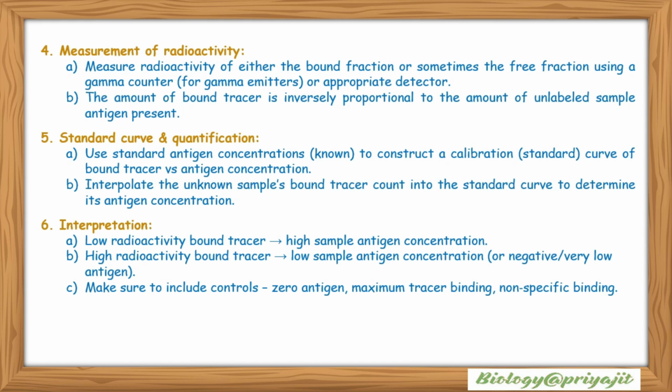Measurement of radioactivity: measure radioactivity of either the bound fraction or sometimes the free fraction using a gamma counter for gamma emitters or an appropriate detector. The amount of bound tracer is inversely proportional to the amount of unlabeled sample antigen.